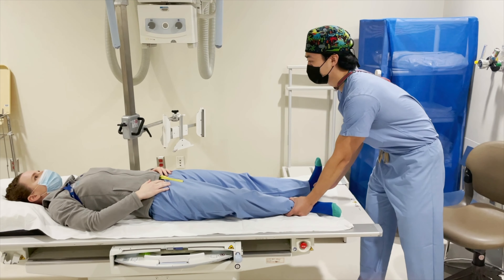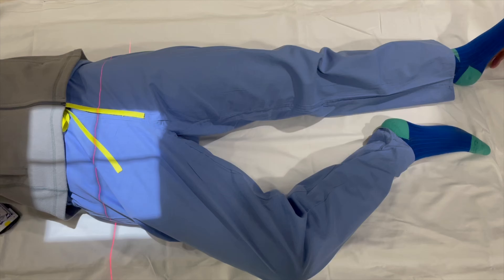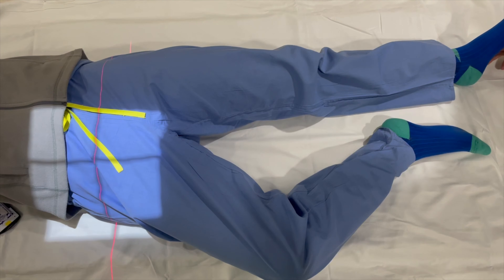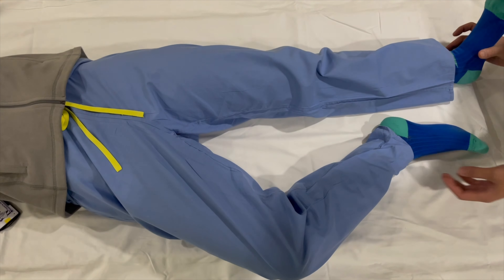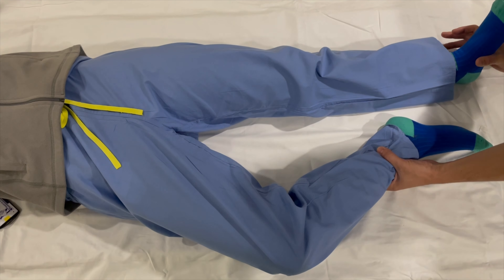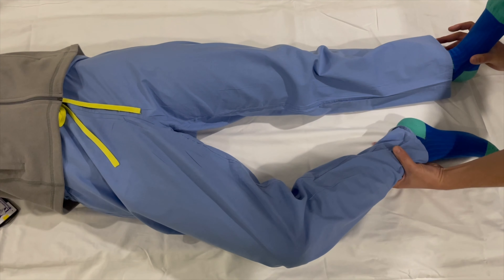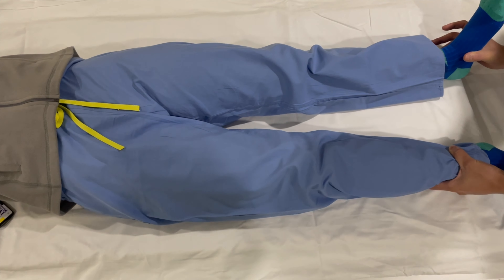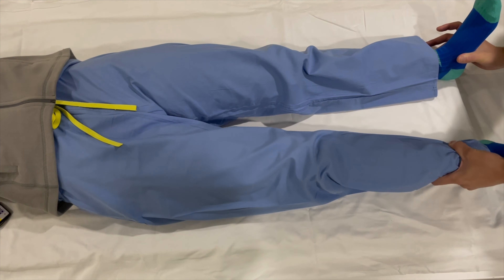This is another video demonstration of the same traction internal rotation view from above. Again, the contralateral leg is held to prevent the patient from sliding down the table. The injured leg is pulled and internally rotated, and the x-ray is shot.